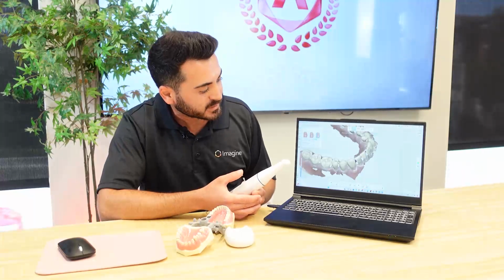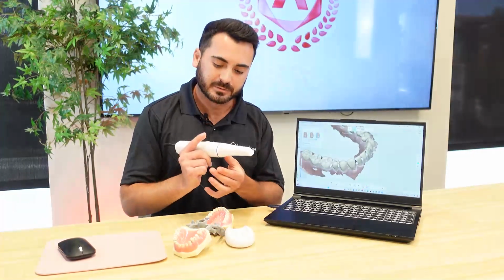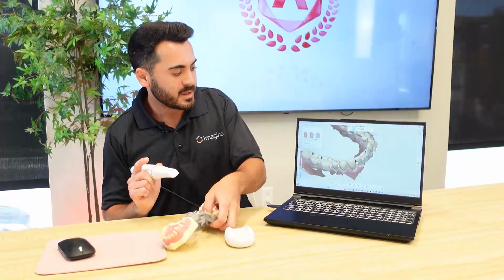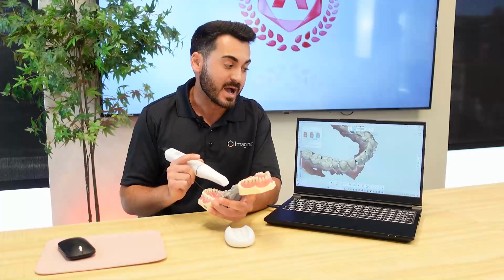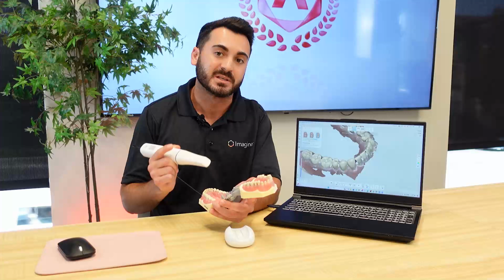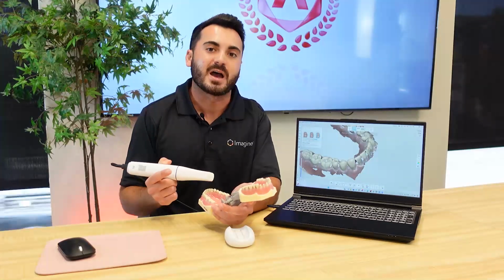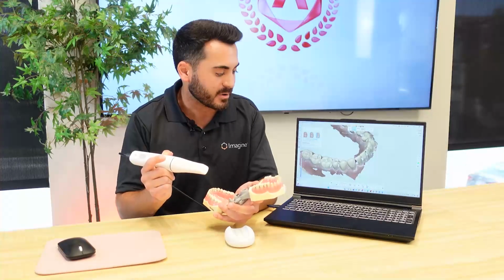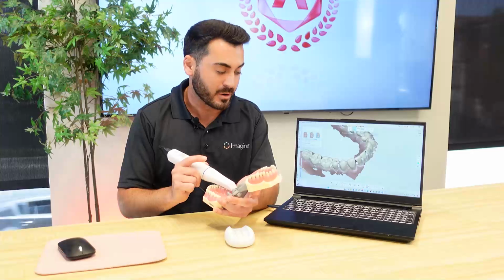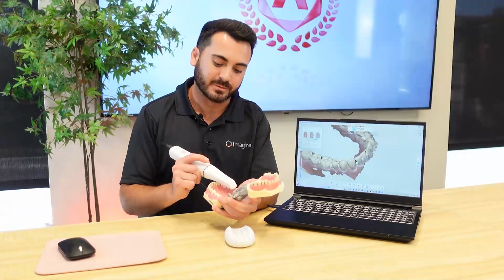Okay. So once I've looked at my scan and I've noticed areas that I want to fill in, we can simply grab our scanner, position it over an area where we already have common data. The main thing that we want to do is make sure to not start the scanner in an area where you have missing data. If you were to do this, you run the risk of having some double images or incorrect stitching. So let's go ahead, we'll grab our scanner and we'll position it right over our molar one more time on the occlusal surface, and we will start our scan process by double tapping the button.